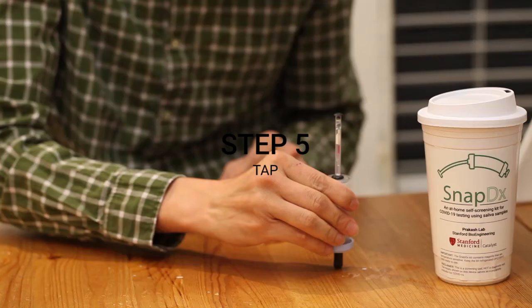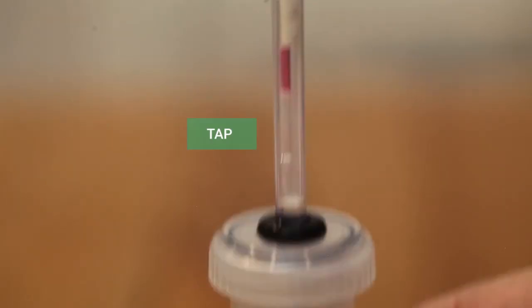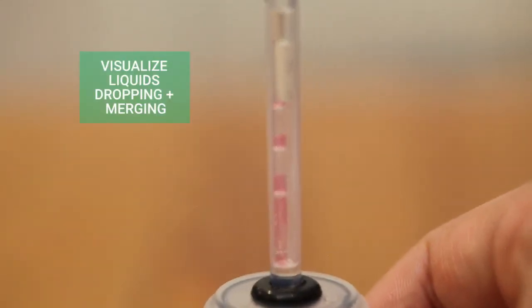Step 5. With the blue cap and button still facing down, hold the SnapDx tube and gently tap the button against the table or surface until the two colored liquids have dropped and merged within the glass tube inside the plunger.